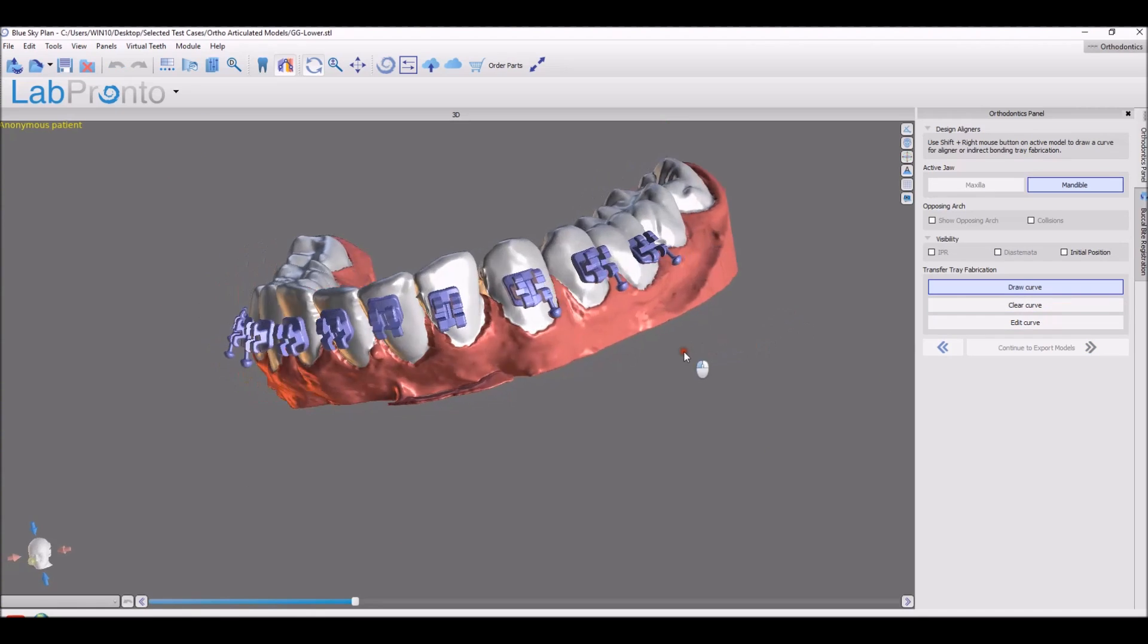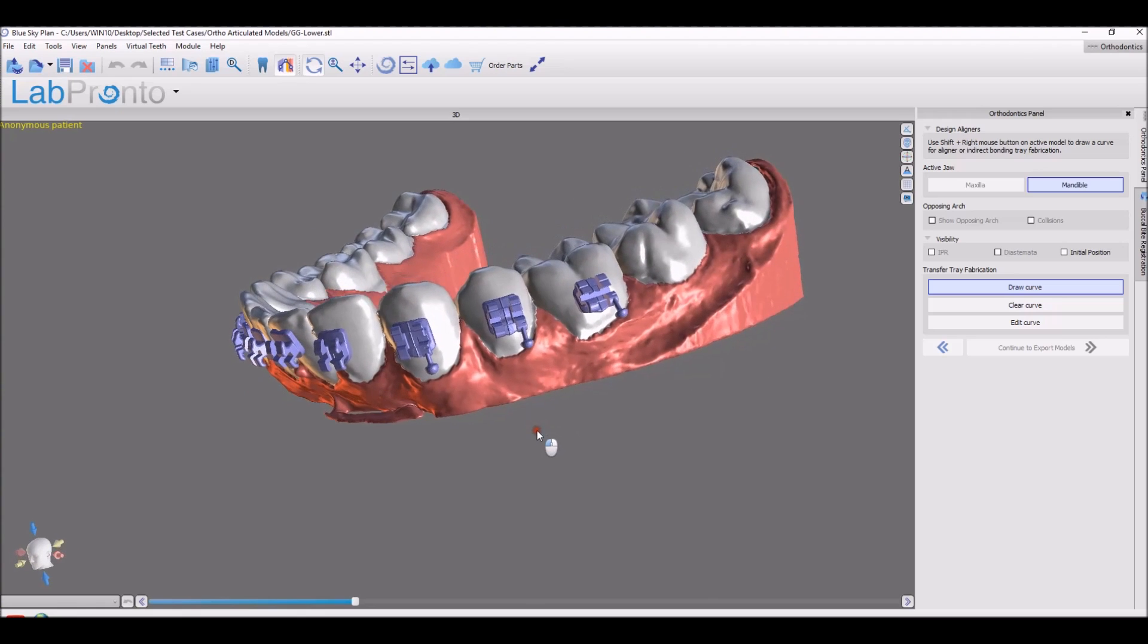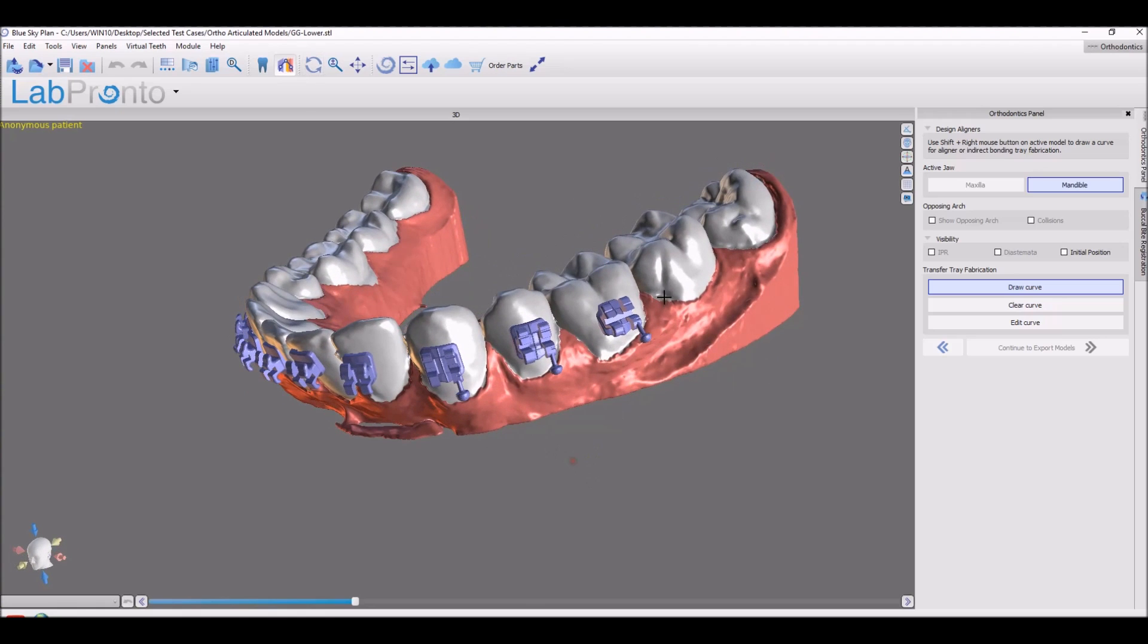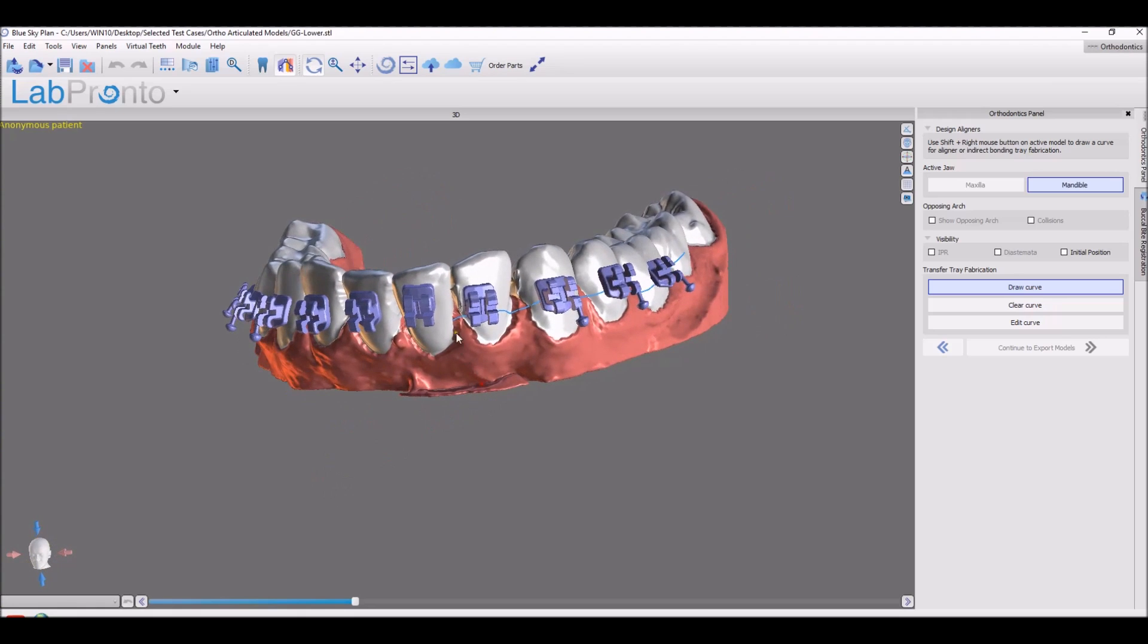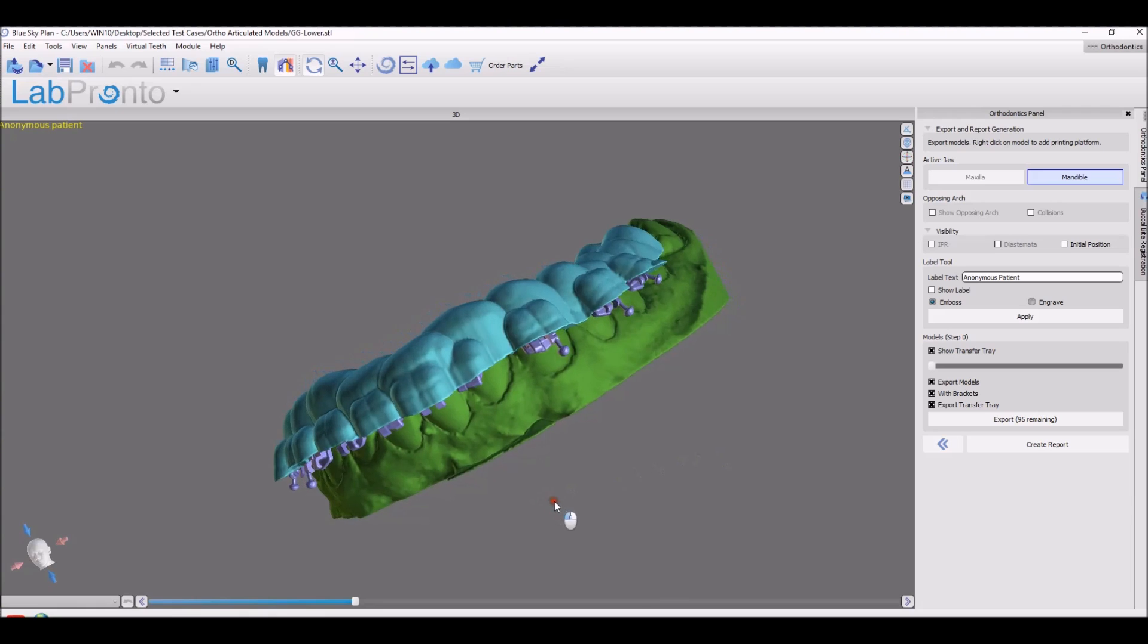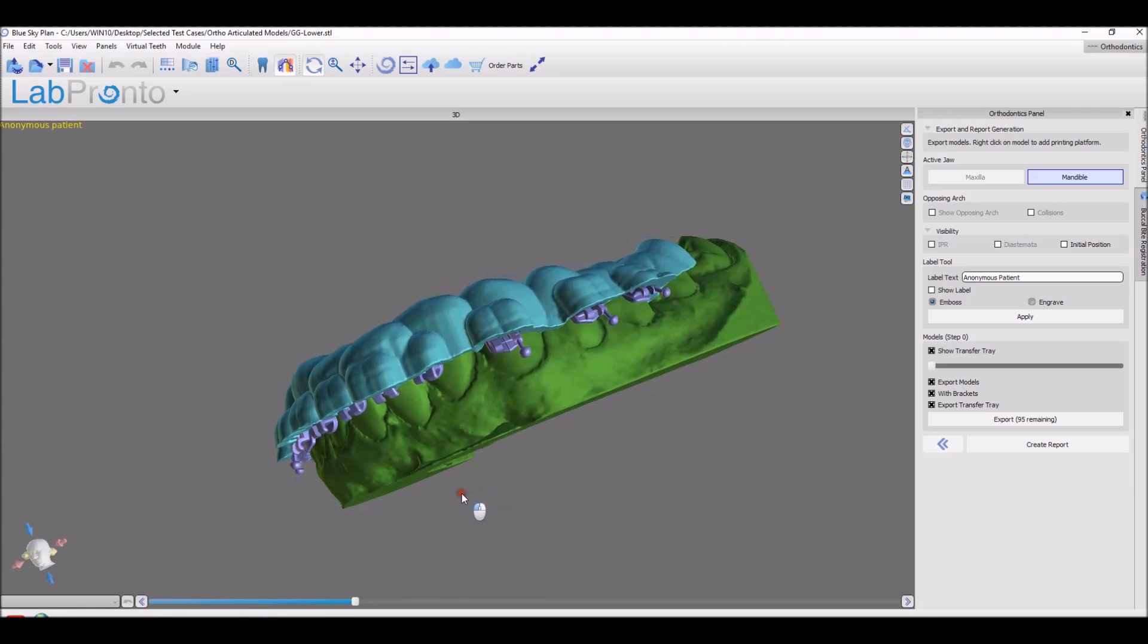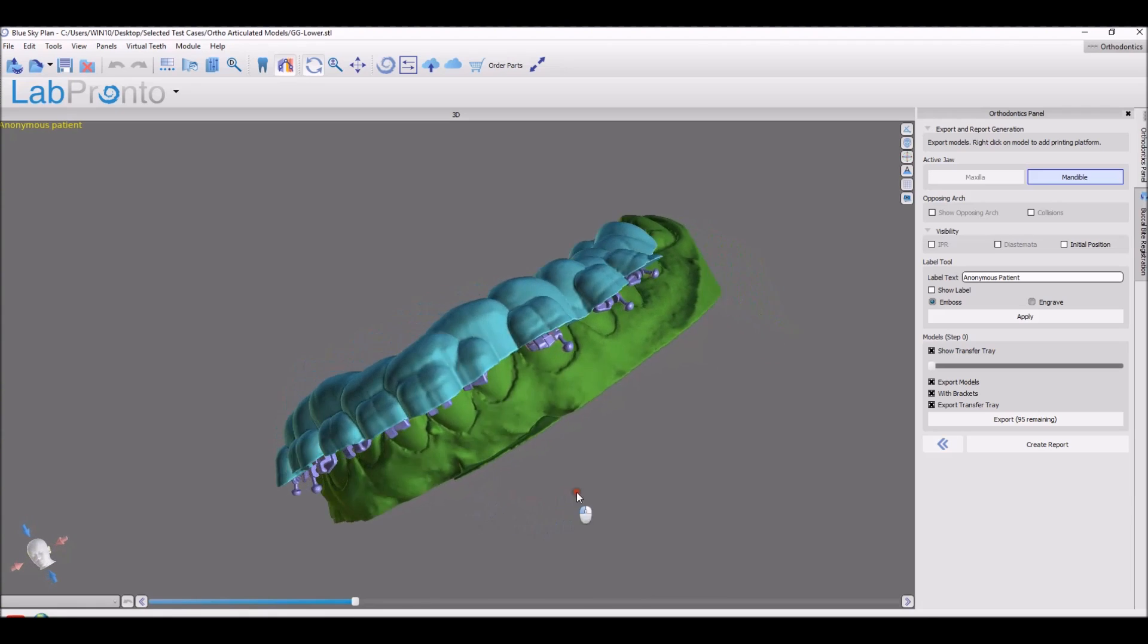You can then continue to design your IBT the same way you'd design a surgical guide for those of you who are familiar. And then you could go ahead and export the models with the brackets if you like, and of course with the IBT.